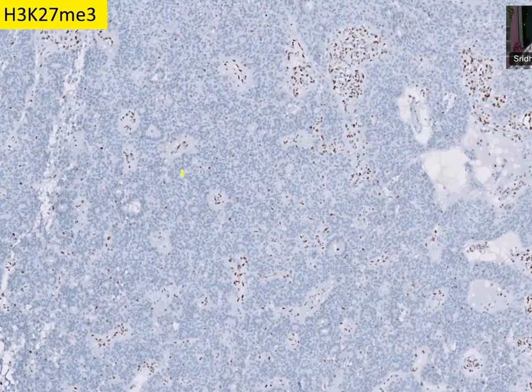You should not use this as a marker for diagnosis of posterior fossa ependymoma. First, you confirm this is an ependymoma by using OLIG2 and ruling out mimickers like BCOR altered; OLIG2 is negative. In a diffuse midline glioma, OLIG2 is always positive, so OLIG2 negativity tells you that it is not a diffuse glioma. You are looking at an ependymal tumor. GFAP we have not shown. GFAP is positive, so here you confirm that it's an ependymal tumor of the posterior fossa.